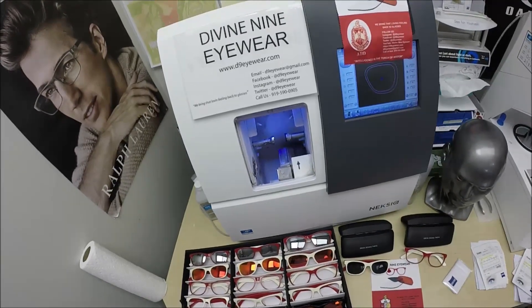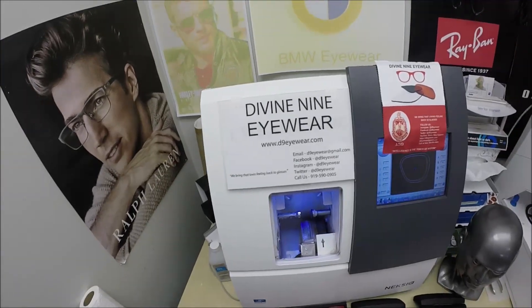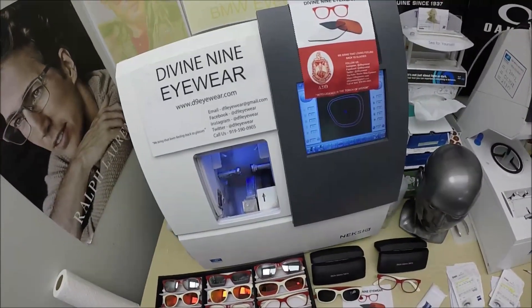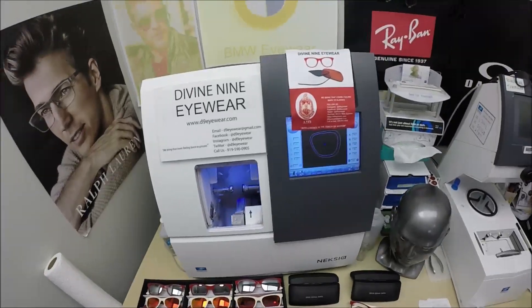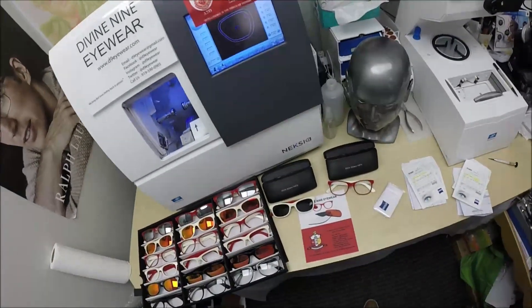Hello everyone, a special thank you to Cheryl in Pine Bluff, Arkansas. This is Divine 9 Eyewear, where we bring that loving feeling back to glasses. My name is C-more Better. I'm the optician behind the lens today, but call me Moe — Moe Better — because I'm having you seeing Moe Better look and Moe Better.